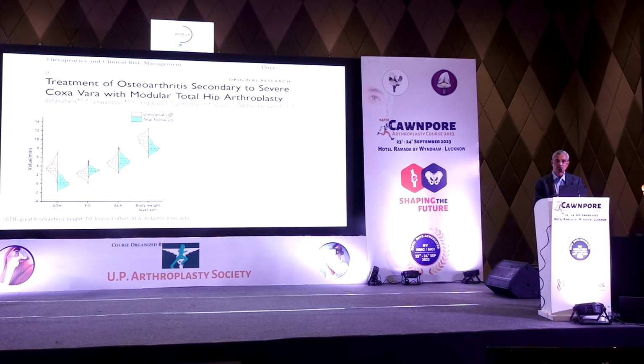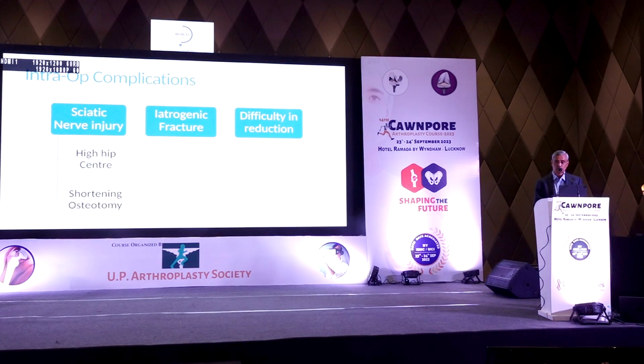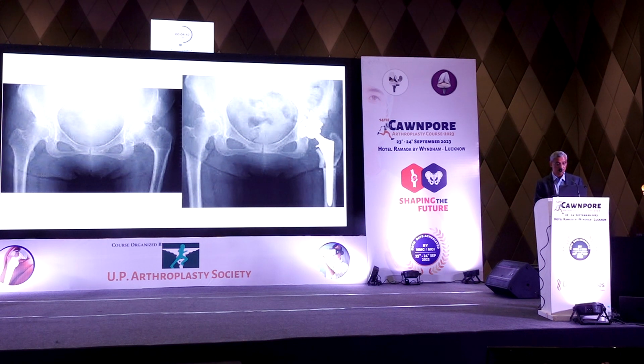But even in modular hips, sometimes, and I will show you some examples from the literature, the trochanter is still high riding and the limitation of abduction may be there. What are all the problems? You can have sciatic nerve injuries like was already shown in the earlier presentation. You will need to do shortening osteotomy in many instances. You can have iatrogenic fractures as was shown in the earlier presentations in the morning. And my biggest problem has always been difficulty in reduction in spite of doing all the tips and tricks that I talked about.